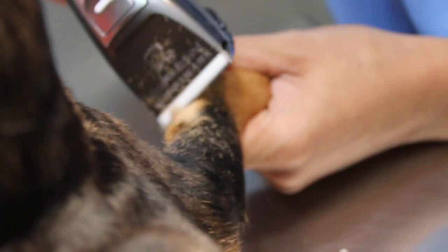The other hand, the other hand. Wait, you hold this one first. I will do it the least invasive way. Because the leg is quite short. Wait, wait, wait. Straighten the leg first. Pull the leg out first.